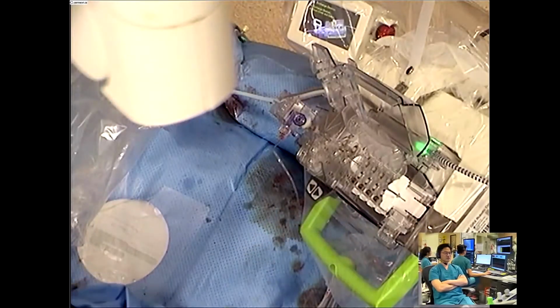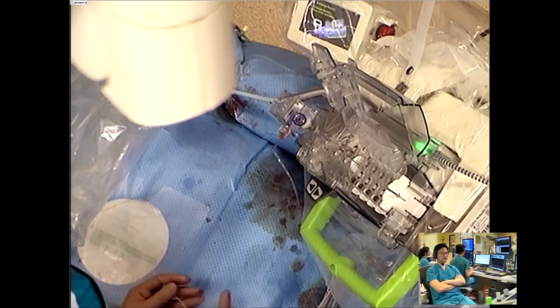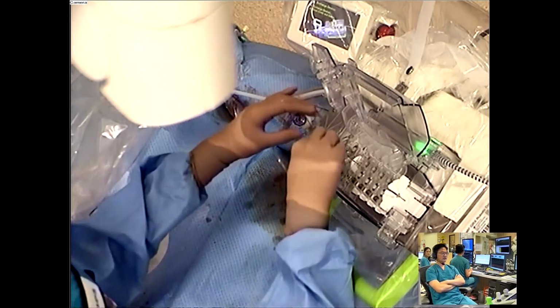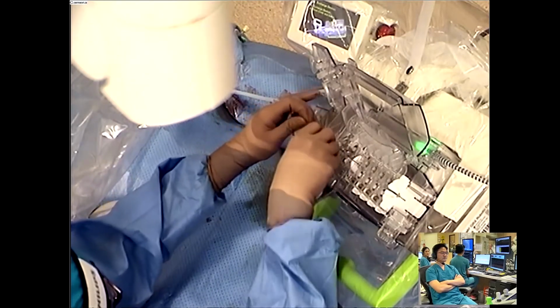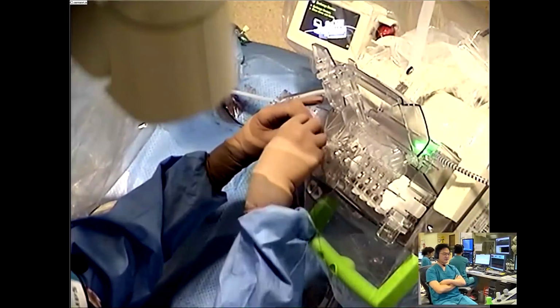She's going to put the workhorse wire in for me next. In this case, I've chosen a Xion blue wire, and I'm just going to wire the LAD using the robot. I'm going to go live very soon.